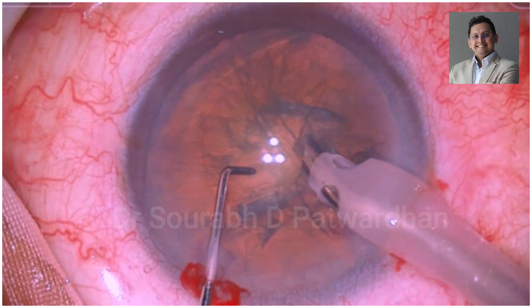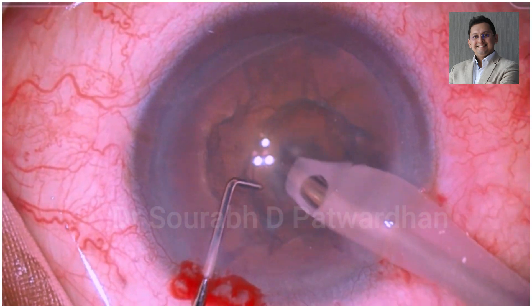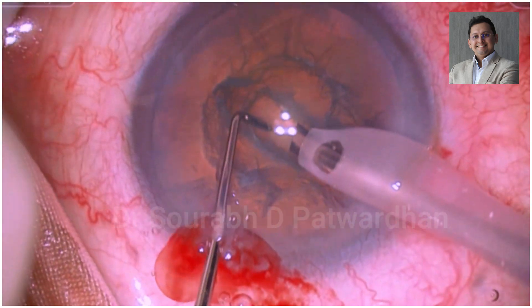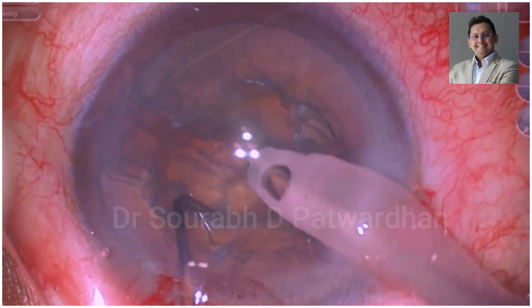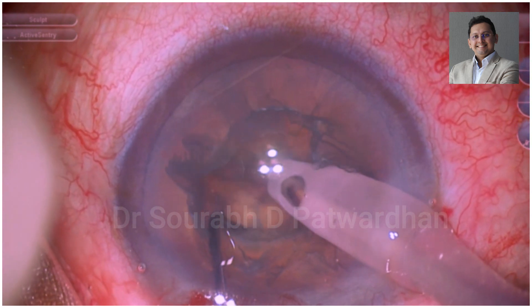This is the second case. You can see again that after doing the deep trench, I am going to position the tip of the chopper in a horizontal fashion and not in a vertical fashion. It is resting at the depth of the trench, and that is how it can divide even a soft cataract quite easily without causing any cheese wiring.